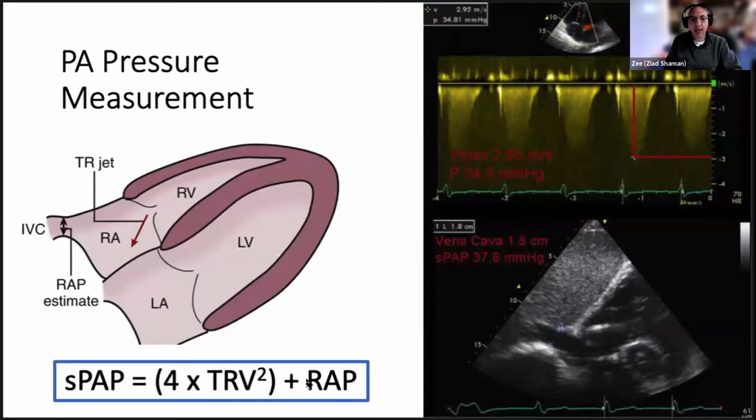If you're looking at this area right here, between the right ventricle and the right atrium, regurgitant flow from the right ventricle into the right atrium is going to happen when this pressure changes into flow, where the flow will have very low pressure but higher speed, which can be detected by the traditional echocardiographic approach to the measurement.